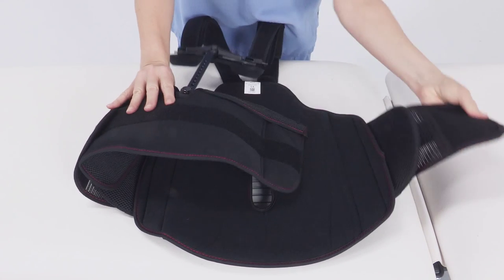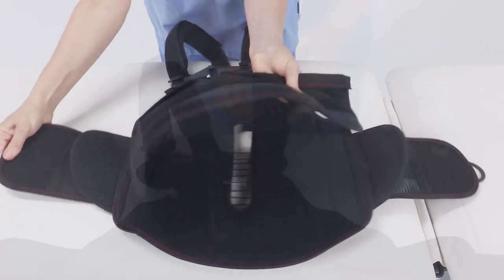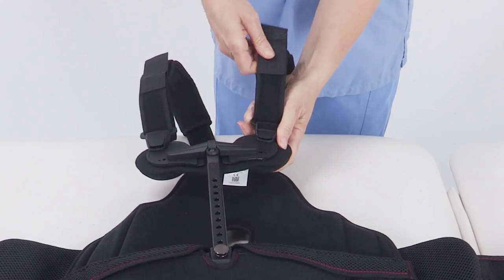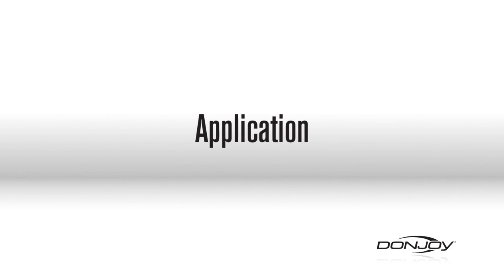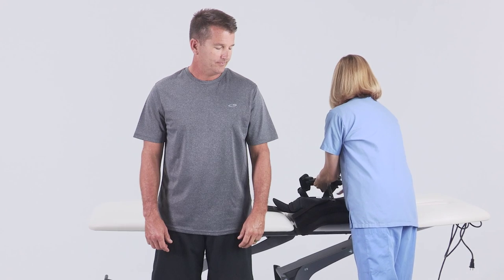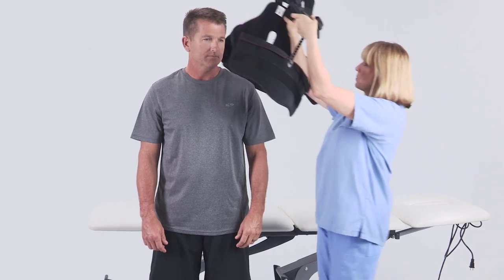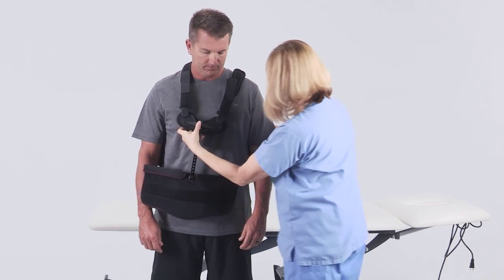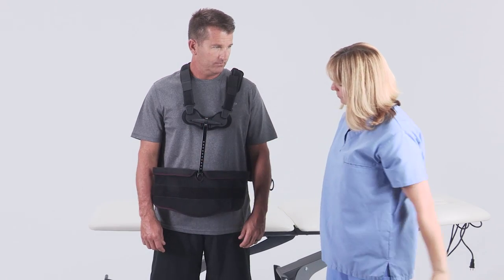Prior to applying, open both of the side Velcro panels. Keep the shoulder straps attached and extend to maximum length. With patient standing, lift the TLSO over the patient's head and lower the TLSO into position. Let the front panel and back panel hang over the torso.